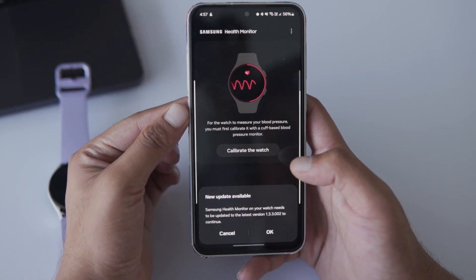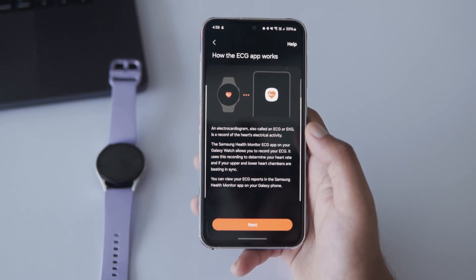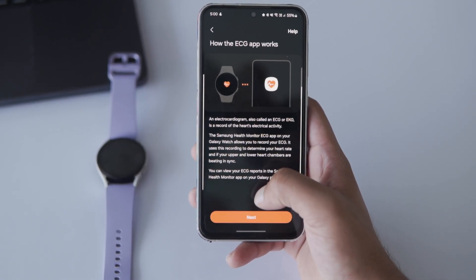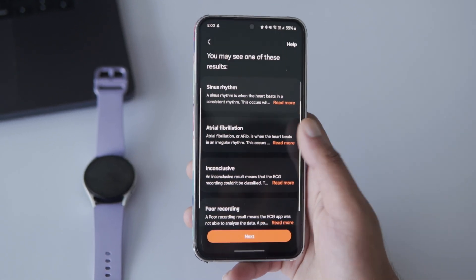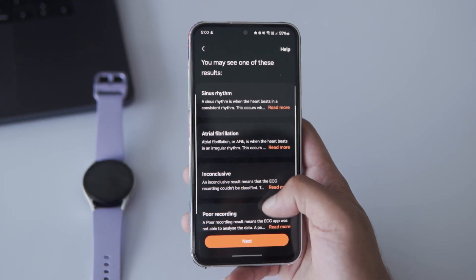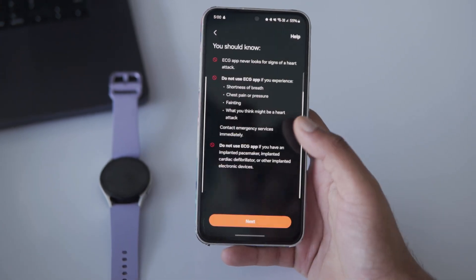The Samsung Health Monitor app will automatically open on your phone. Just tap Get Started. On the next screen, it explains how the ECG works, so tap Next. After that, you'll see a screen showing the 4 possible results you might get. If you want more info on these, you can tap and read more. Otherwise, tap Next.